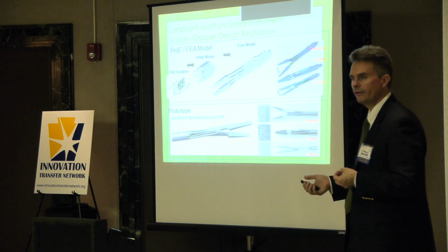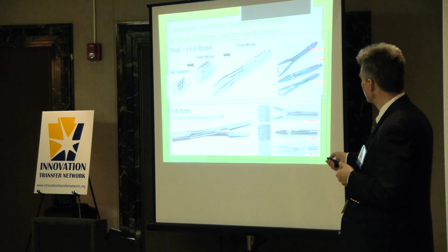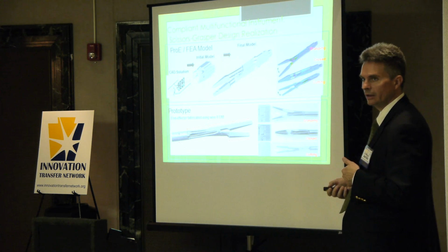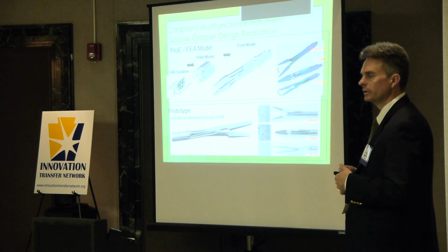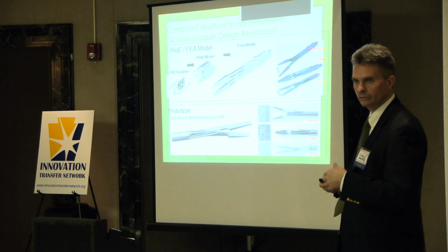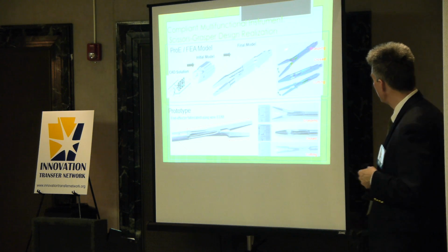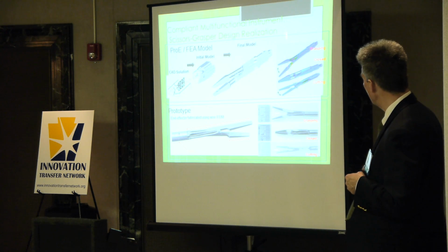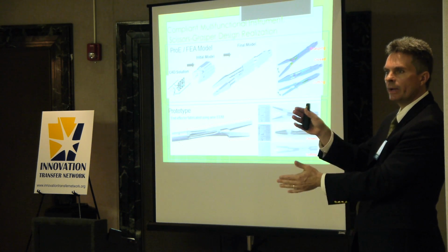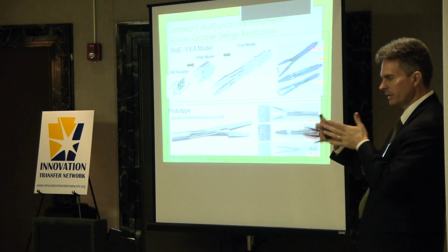And this is a little bit more of an advanced slide of what we did, taking what we saw before. So Dr. Frecker took our specs, modeled this into this block, and actually a substantial value of what we created with this project is her modeling algorithms of these compliant mechanisms. So you turn this into something that looks more like an instrument, and this instrument, by pushing on it this way, will open, you push on it that way, will close, and you push on it a different way, will now actuate independently and scissor. So this was an early work to create a combined grasper scissors by pushing on it different ways.